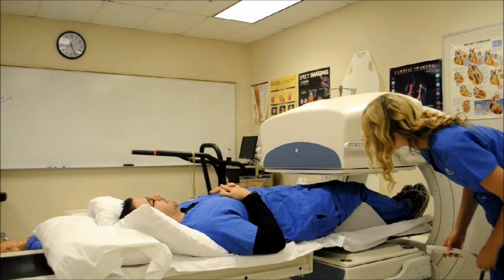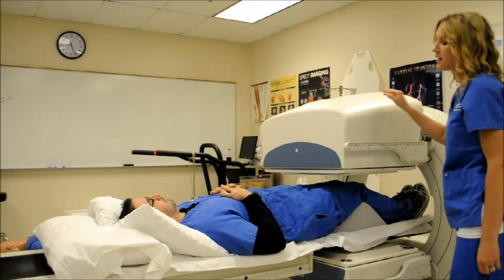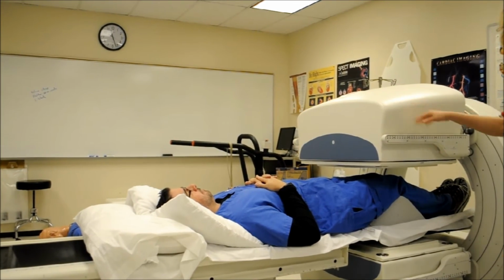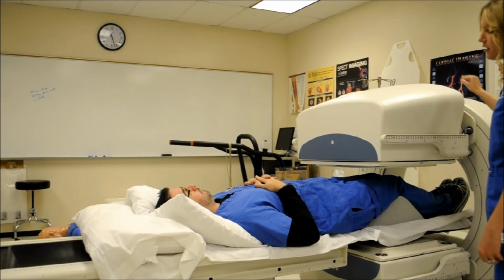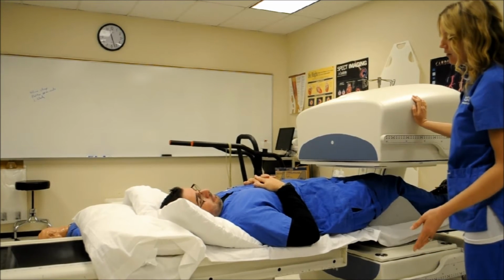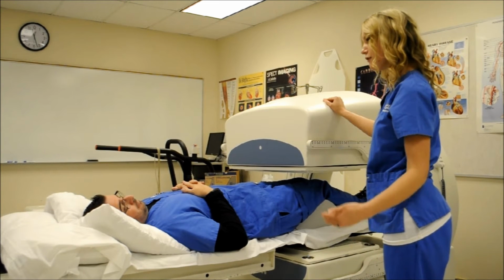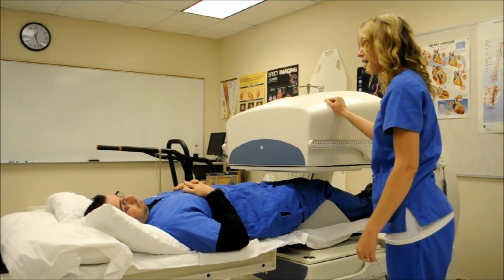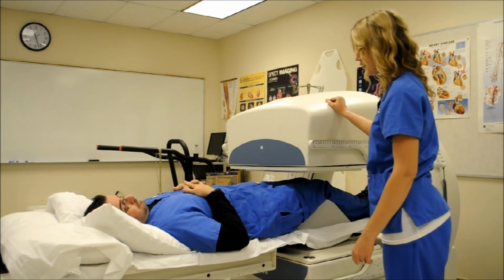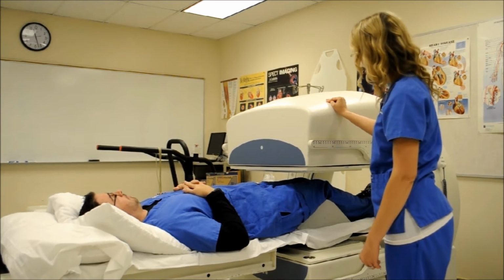How are you doing, Rusty? Very good. All right, so this first part is going to take about 2 minutes, okay? All right, so just be nice and still. And then afterwards, the camera's going to immediately go into the other phase where the nuclear medicine is in your tissue. So first we do the venous phase where we watch it flowing through your veins, and then we're going to do the tissue phase, and it automatically goes right into it, so don't move.